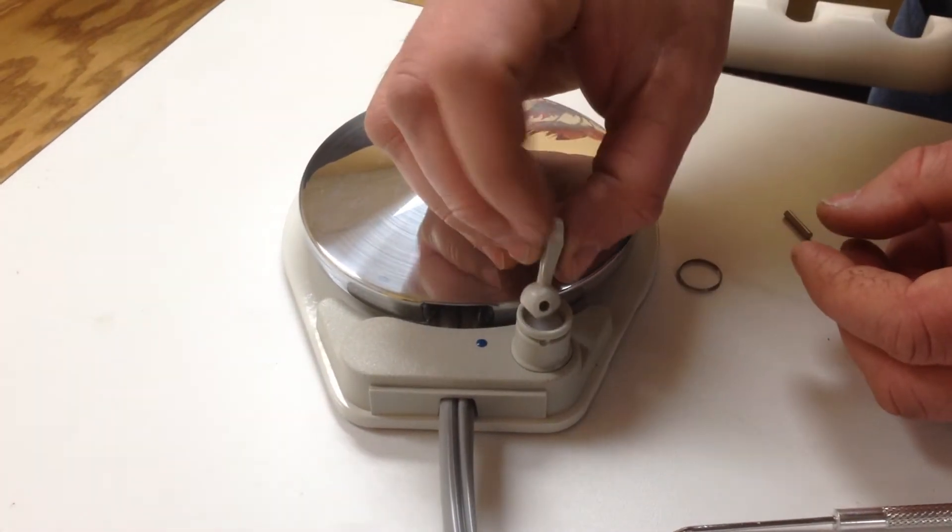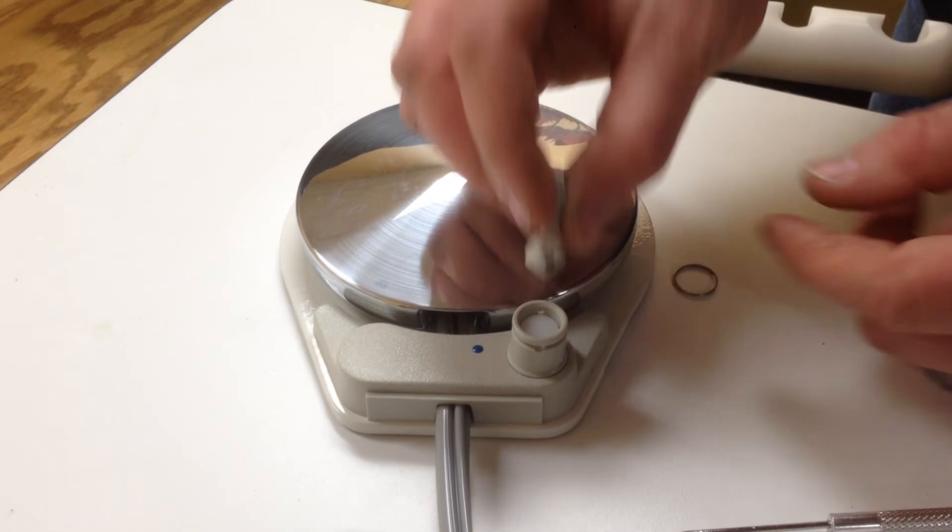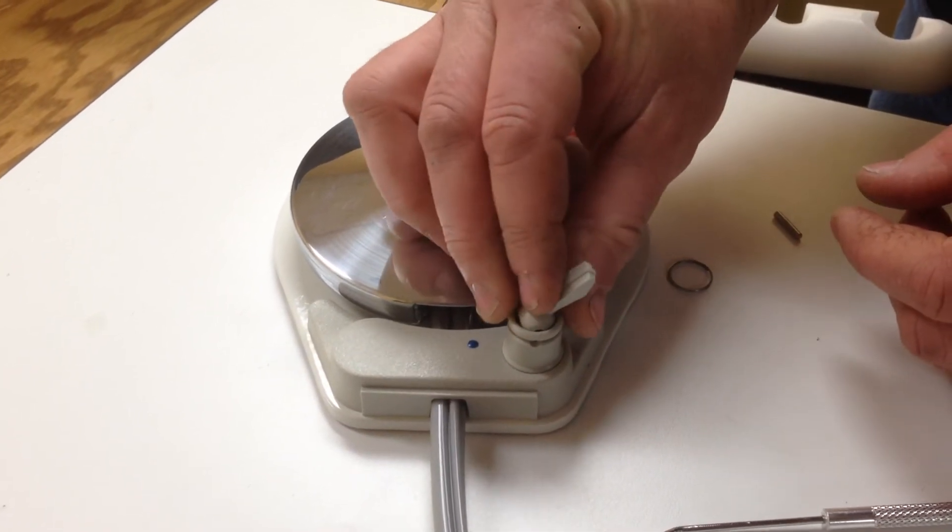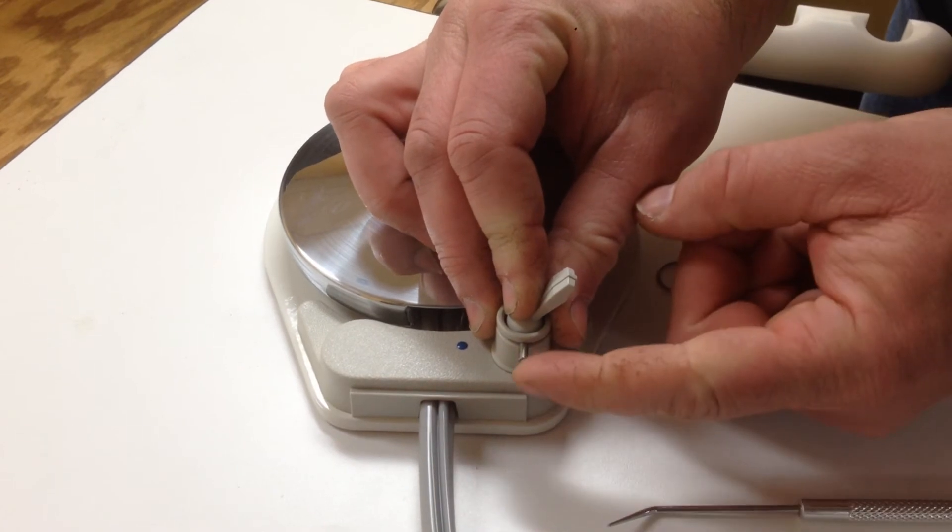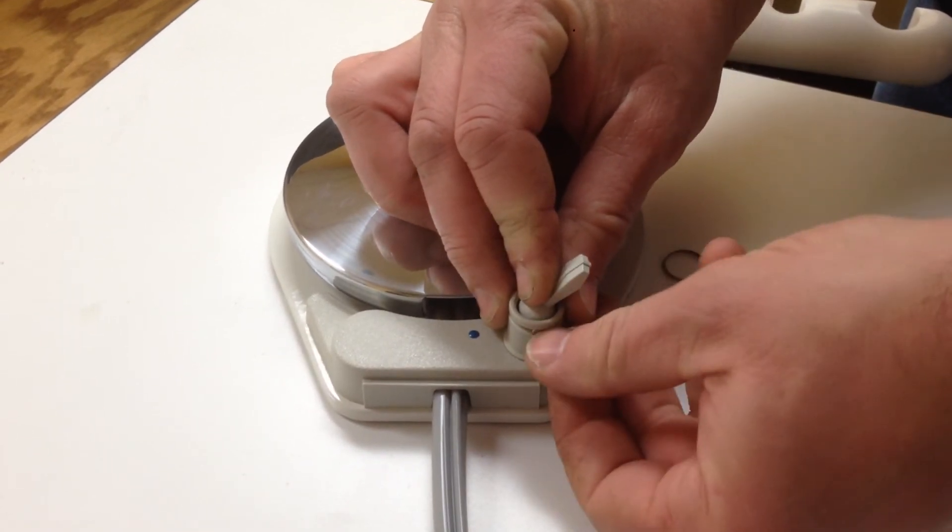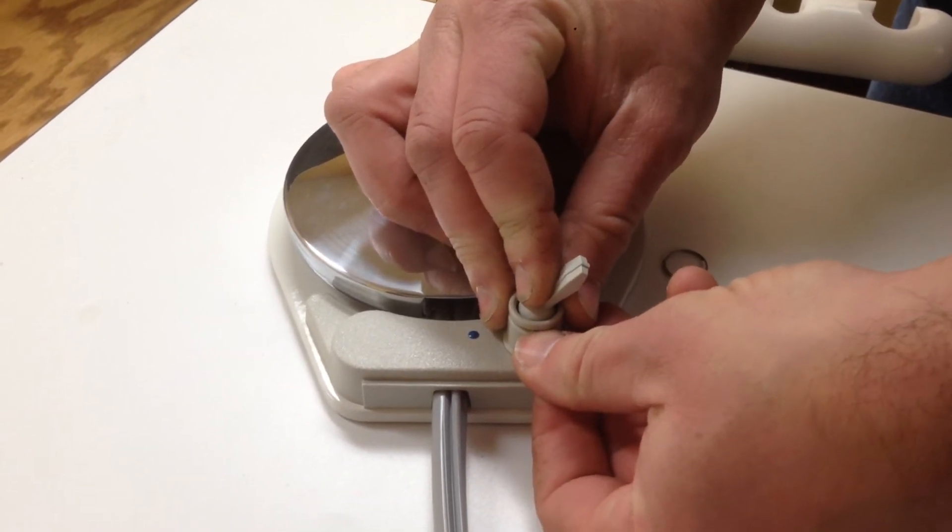To put it back in, just put it in to where the larger flat side is facing so the toggle fits away. Push the pin back in like so, get it flush inside there.